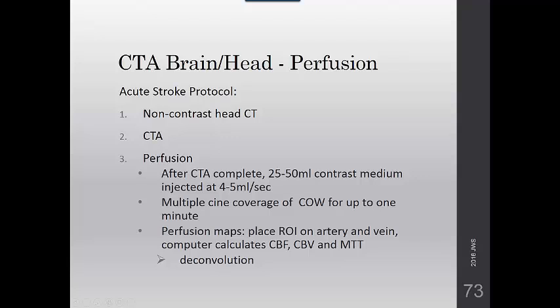This is 4071. We're still in lesson 1 in imaging studies of the brain. Today our topic is going to be on perfusion scanning. CT perfusion studies are specialty studies that are performed to provide information of blood circulation in the brain. Perfusion studies are obtained by monitoring the passage of iodinated contrast through cerebral vasculature.